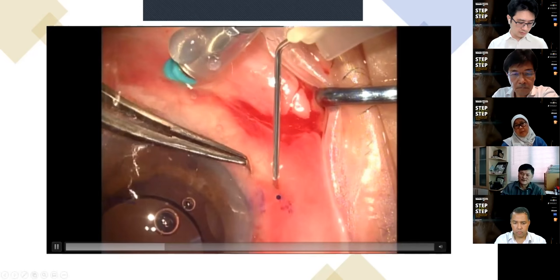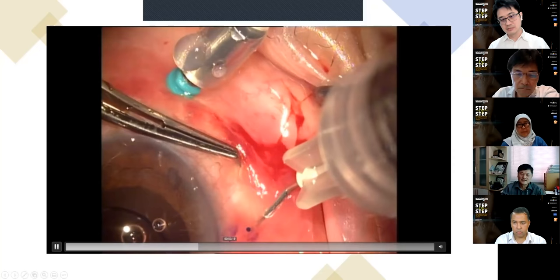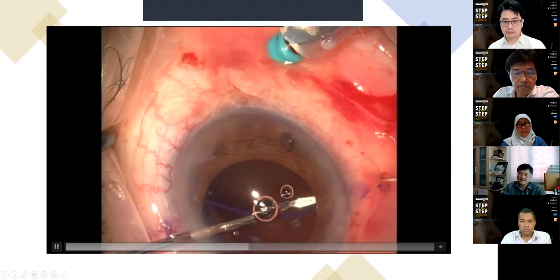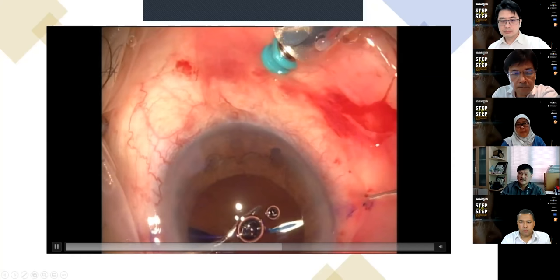Again, 27G needle entering the sclera at a different spot. And I try to catch the haptic again. I have to use the needle to pull the haptic, push the haptic optic away in order to see the haptic. As you can see, there's a lot of distortion at the optic-haptic junction here. But this is a PVDF, so it can withstand this kind of pressure. So the haptic is now slid into the needle.